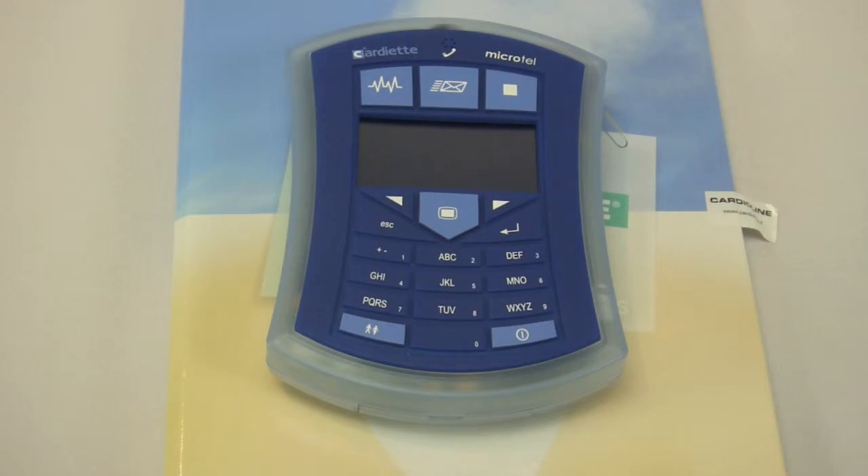It can operate in a real-time mode where you can view the EKG waveforms in real-time on a PC over Bluetooth. It also has a test-and-send feature where you can take a full 12-lead EKG away from the computer, save it into internal memory, and upload it at a later point in time.